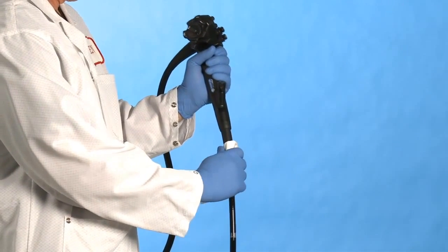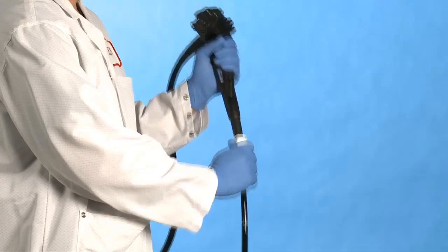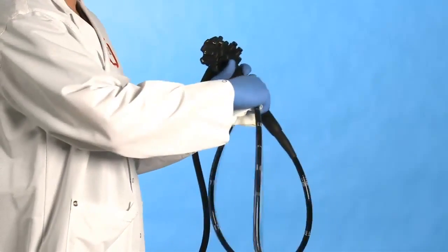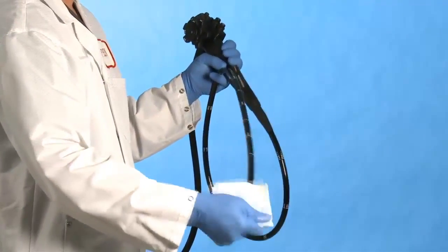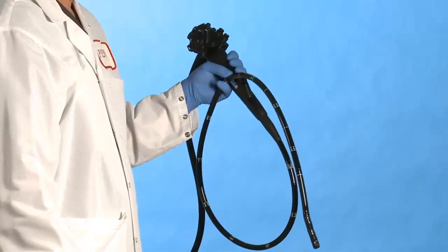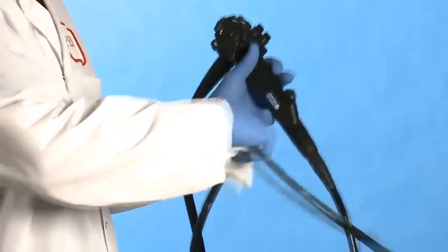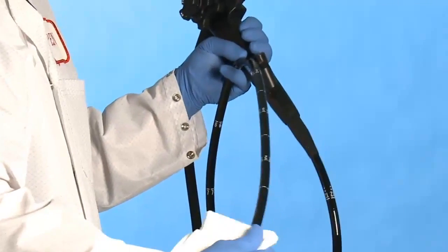Immediately after the procedure, with the endoscope still connected to the processor, wipe the insertion tube with a lint-free cloth saturated with enzymatic solution that has been diluted in accordance with the manufacturer's instructions. Wipe in a downward motion from the control body root brace to the distal end of the endoscope. Do not pull the flexible tube through your hands in order to avoid potential impact damage to the distal end.